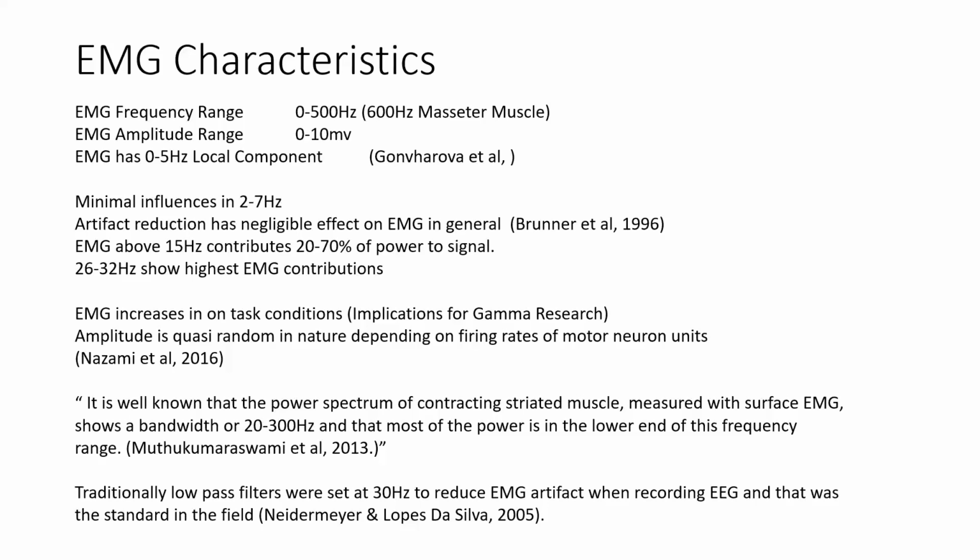Now, one of the reasons there may be a difference between the 0 to 500 and the 20 to 300 is that 0 to 500 may be putting needles in the muscles, where the 20 to 300 may be more just collecting off of a skin surface sensor. And you get different information doing that, just like you do with EEG.